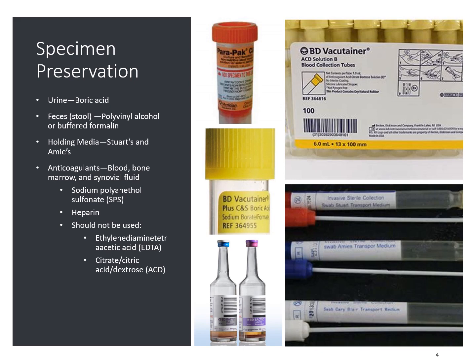and so they have something in them to either prevent the organisms from being exposed to air, or to provide some sort of extra nutrients, or to prevent the organisms themselves from drying out. With your blood cultures, you see those two bottles at the bottom that actually look like bottles.